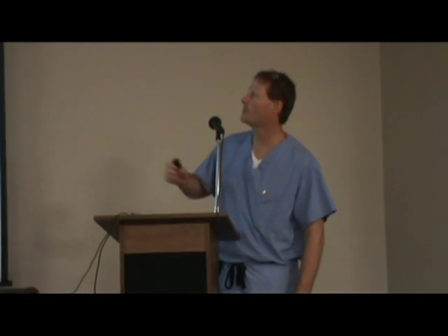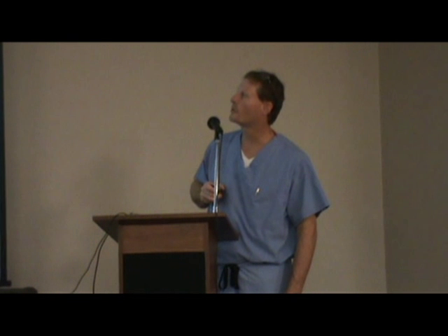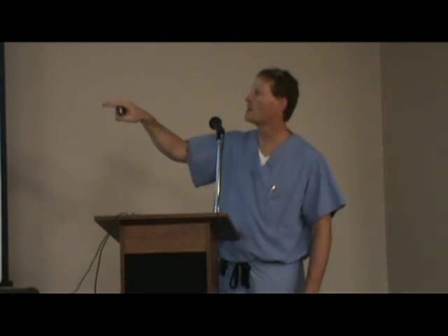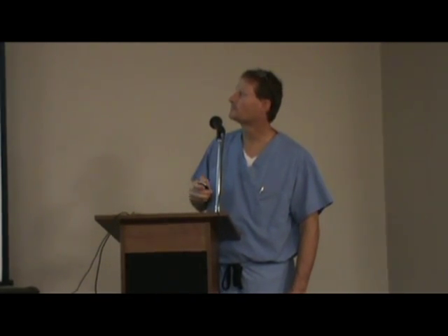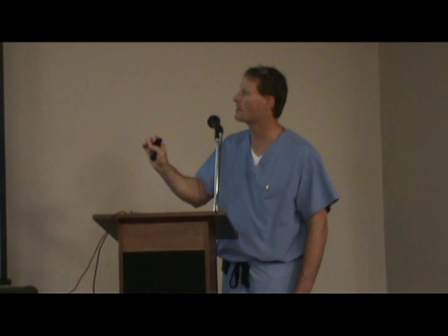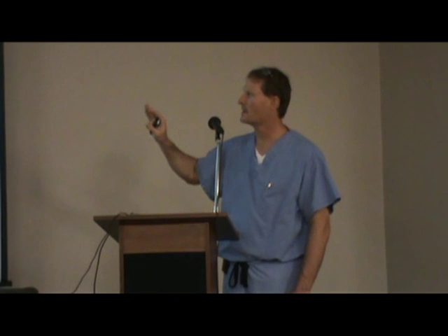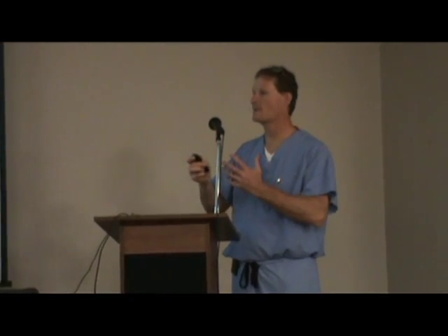That's the back of the femur — actually the femur is upside down — on the posterior condyle of the femur. You see that blue burr coming in. All the green stuff is to be removed, and once it looks white, it's been removed. That's on the tibia — the lower bone, looking straight down. And that is what it looks like intraoperatively: a knee that is being burred. Those little black things with the silver holes in the middle are the tracker balls that tell the computer exactly where the femoral head and the landmarks on the knee are at all times, and that's what guides the robotic arm.